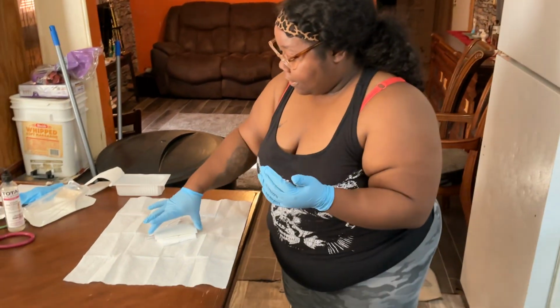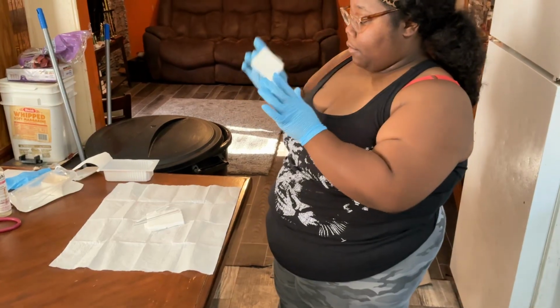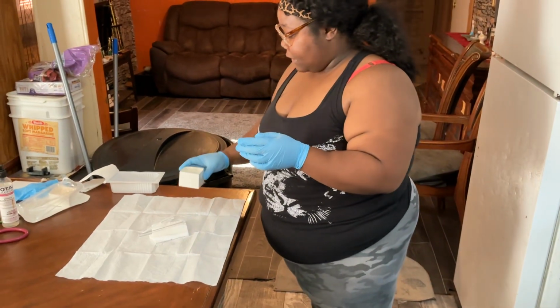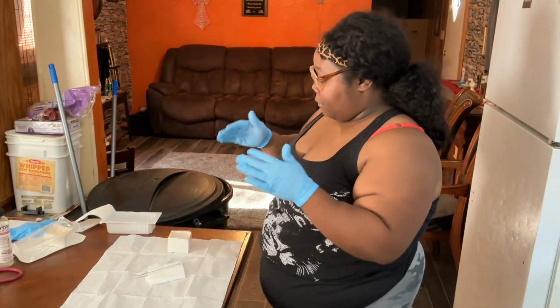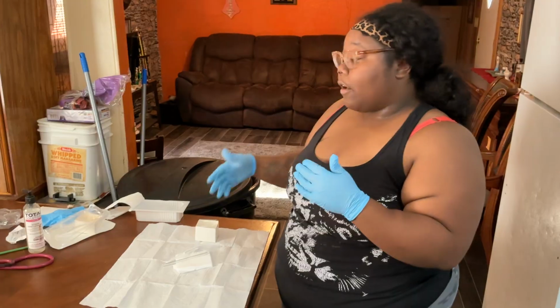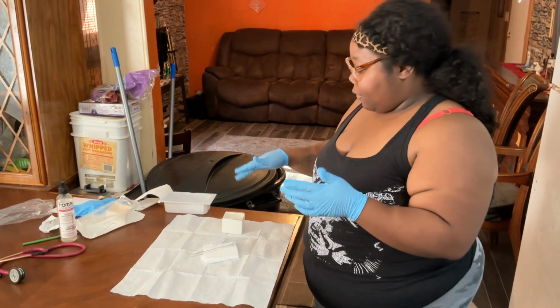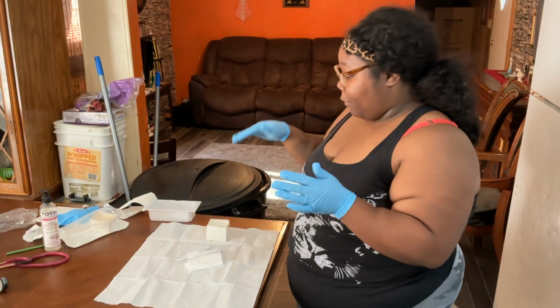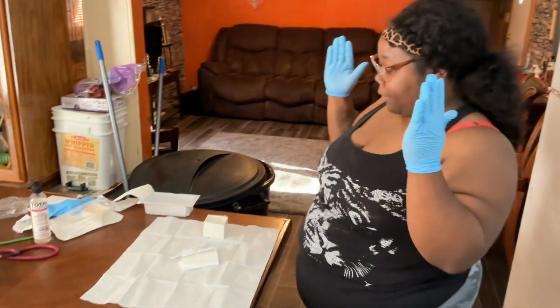take my sterile cup here. I'm going to place it right here because it was still inside of my sterile field. So I will put some solution inside of here. I don't have it. I have that, but it's not what I need because I didn't put it in my bag. But I would put some sterile solution in here, and it is sterile solution in there as well.